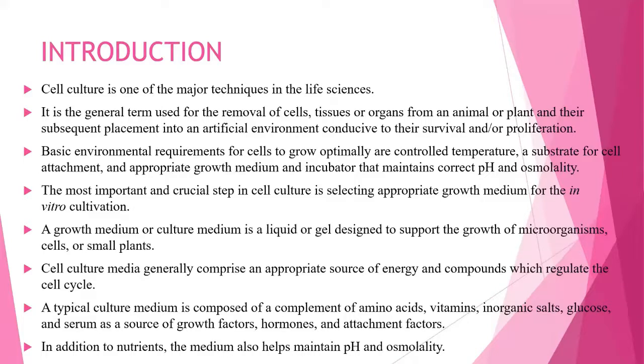This energy is provided not only by the supplements that we added. The media itself is also enriched with different types of vitamins, growth factors, and amino acids that are required, and antibiotics can also be added to prevent contamination. So that is a point which is mentioned.